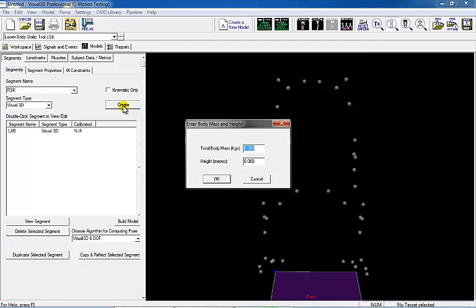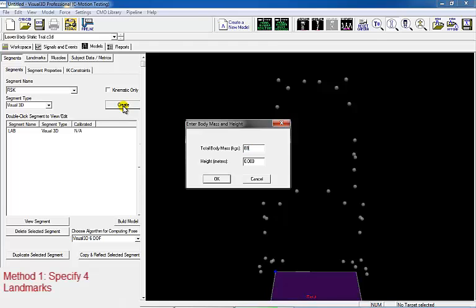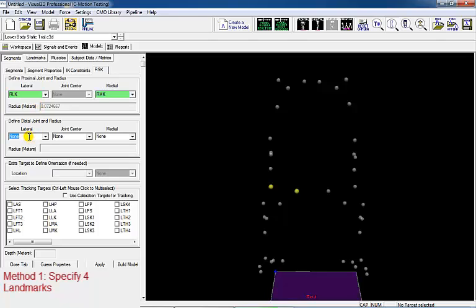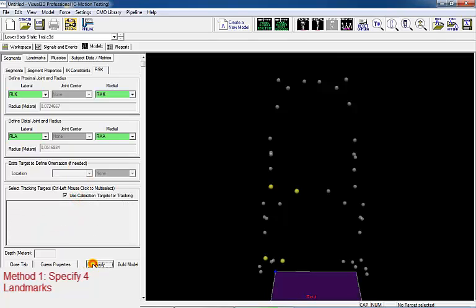The first method we are going to use is using four targets to define the shank segment. We will use the lateral and medial knee markers to define the proximal end, and the lateral and medial ankle markers to define the distal end. V3D will auto-populate the radius of the distal and proximal end. Since we will not be using this model to process data, we'll use the calibration targets for tracking.